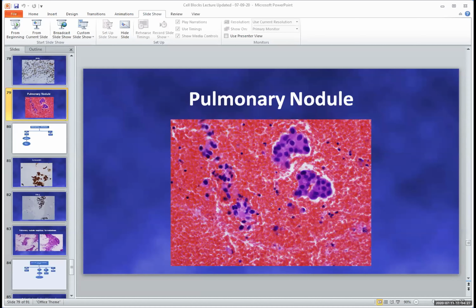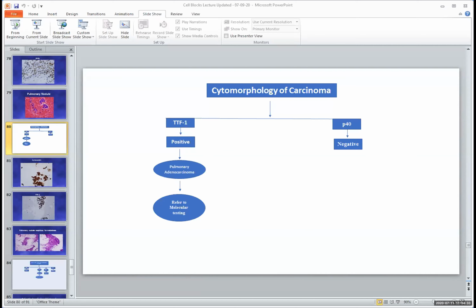I would favor an adenocarcinoma on this morphology, but in general, to allay the fears of my clinical colleagues, I will perform a very limited immunohistochemical panel so that they can put their little check in their checkbox schemes for their treatment panels.